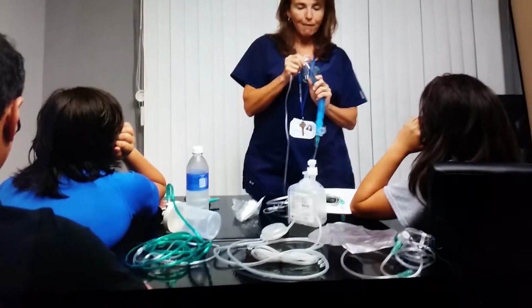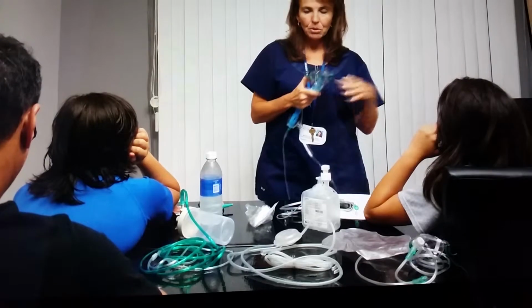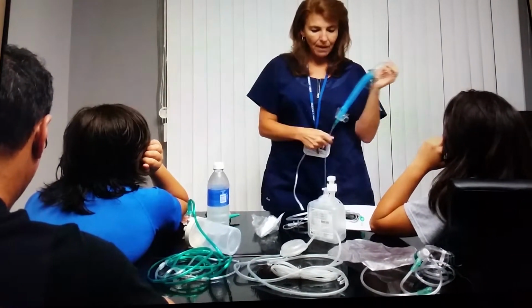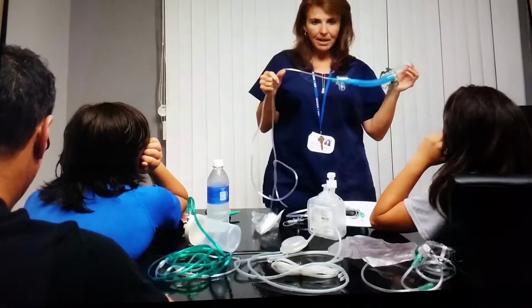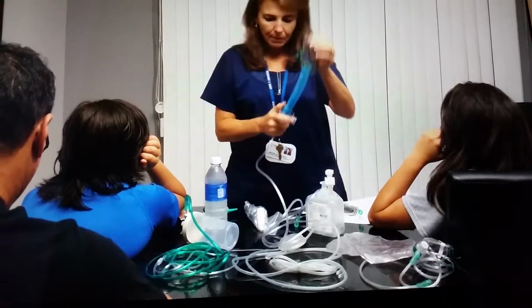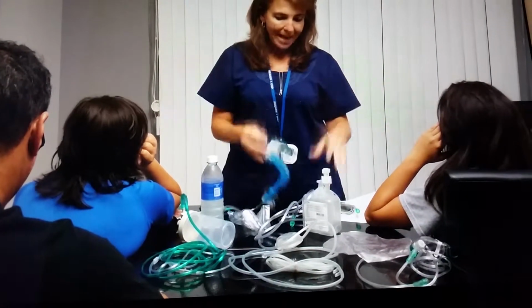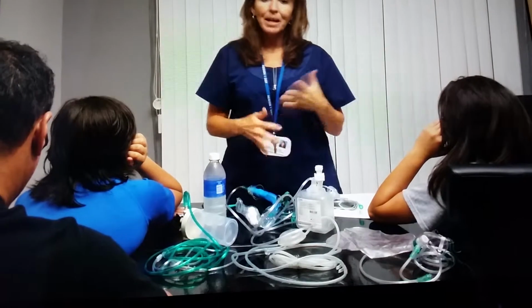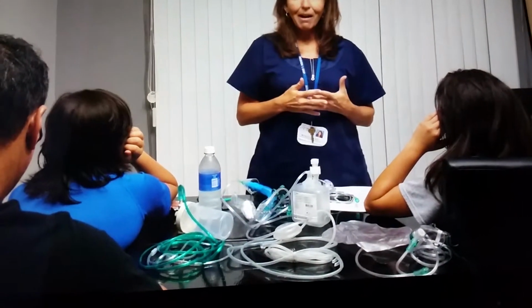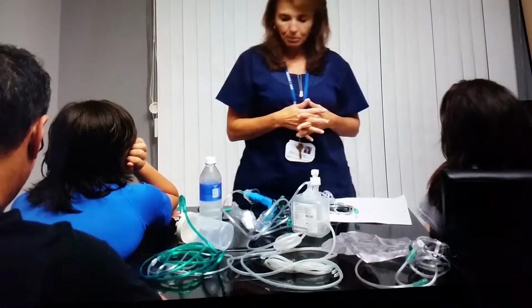Most masks require 5 to 6 liters to flush out your exhaled CO2. So we don't want retention under the mask, therefore we want to ensure that this is the only mask that has that exception. This mask is typically used for COPD patients. Once you've passed that 50% range and the patient is becoming a little more unstable, you want to go to either a high flow cannula or a non-rebreather, which will give you 100%.